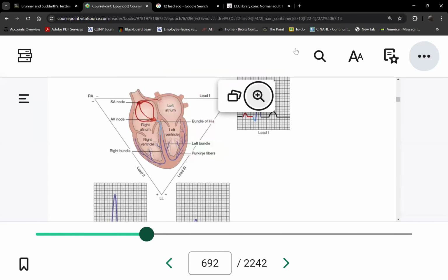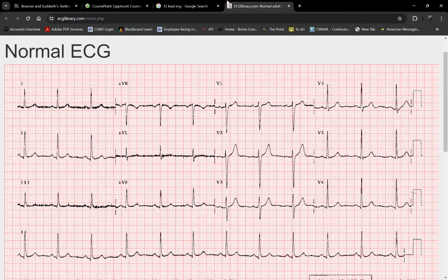Okay. And all illustrations, therefore, when we discuss it, will be taken from lead 2 because we can't use the other leads. For instance, if you look at V1 or aVR, it looks inverted, correct? Because let's say aVR is taken from the right shoulder.